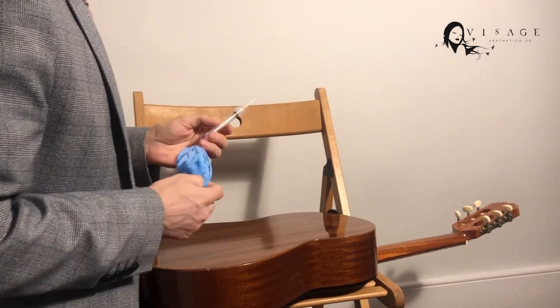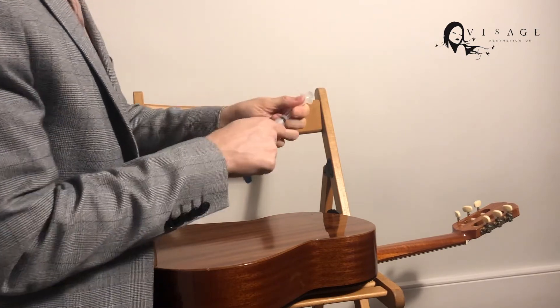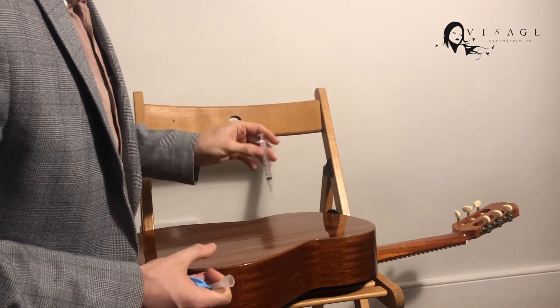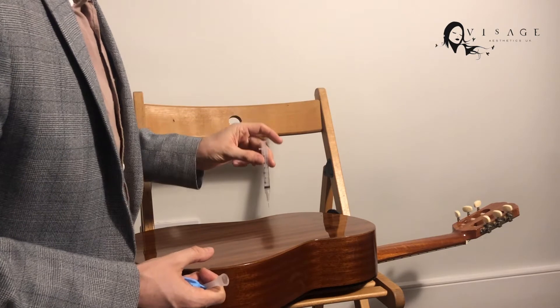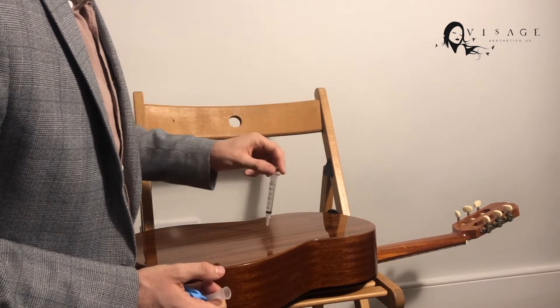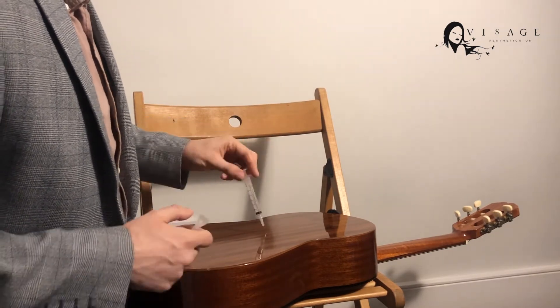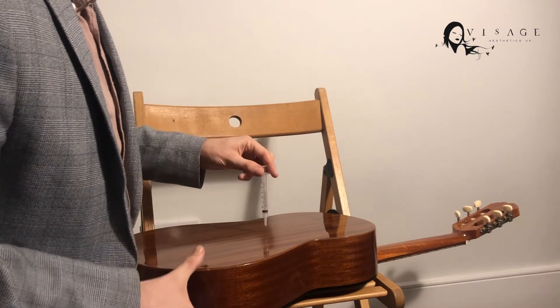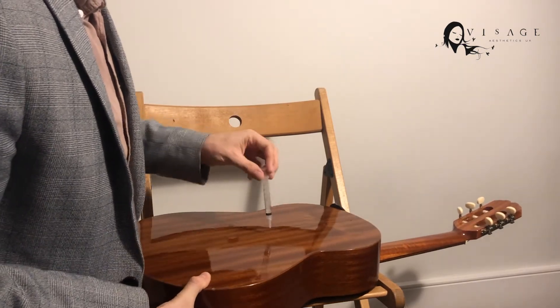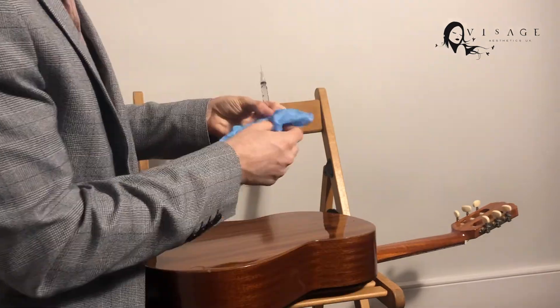When you put a needle onto wood, or onto bone or periosteum, you put the needle down and wiggle it — it pivots around a very fixed point. That tip of the needle is fixed in that point because the tip of the needle is embedded.